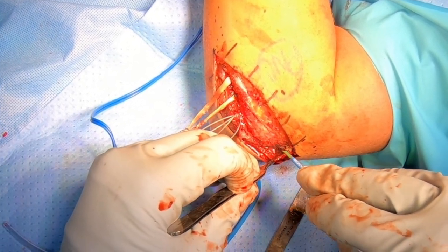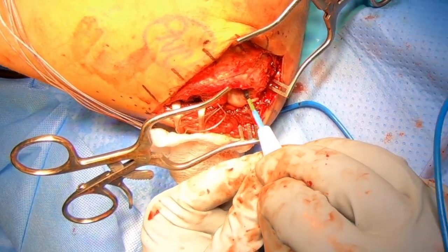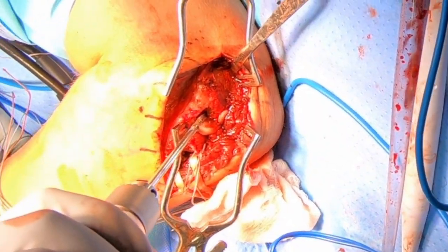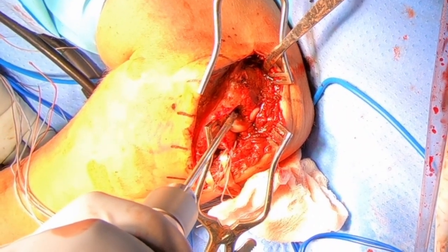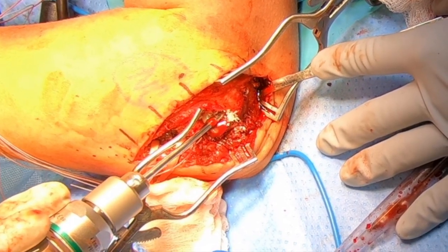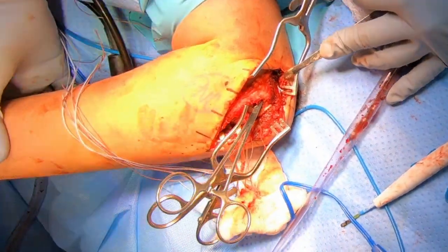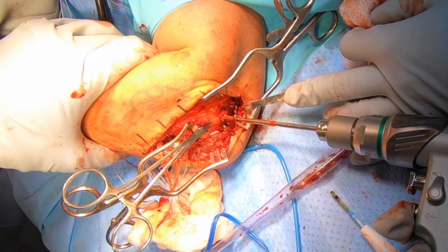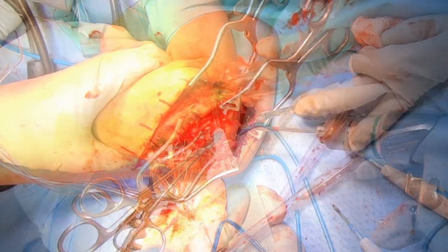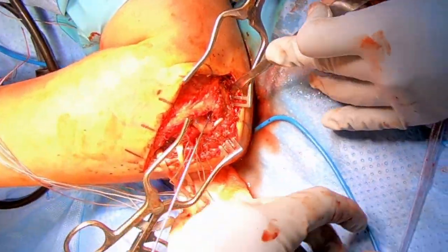We're going to prepare on the upper arm bone side to cut our tunnel. The tunnel placement here is very specific — I have to be very careful, as this is the hardest part of the whole surgery. It's got to be perfectly placed. I like that spot — it's right in the center of the curvature of the capitellum. We'll aim that to come out the back of the upper arm bone. Then I'll put in a clamp because I'm going to create another little Y within that tunnel to pass my graft through. Once I hit the clamp, I know those holes connect. Then we're going to use this instrument to pass sutures through those tunnels.